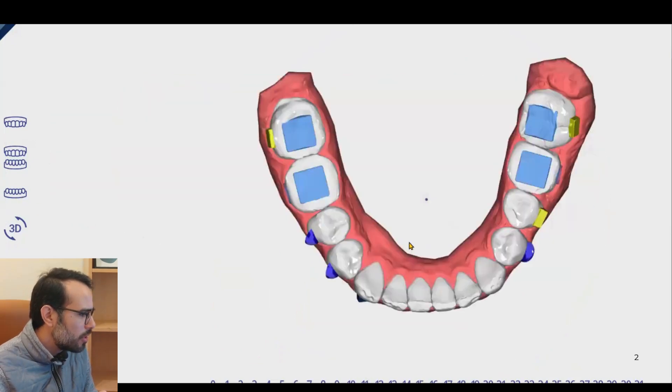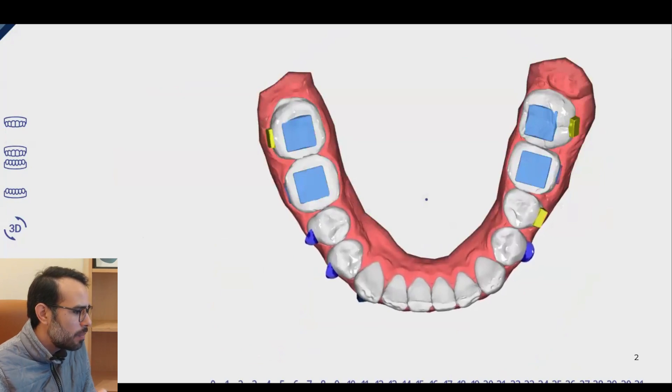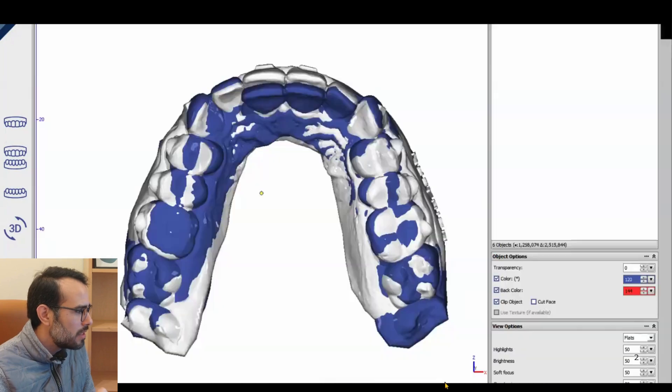So let's see how the treatment plan. And the lower arch, we didn't have much movements, very light movements. And let's see what happened. Let's go to the case.